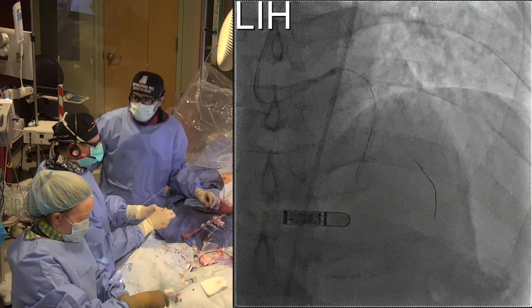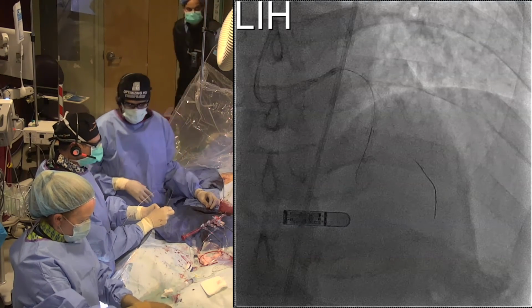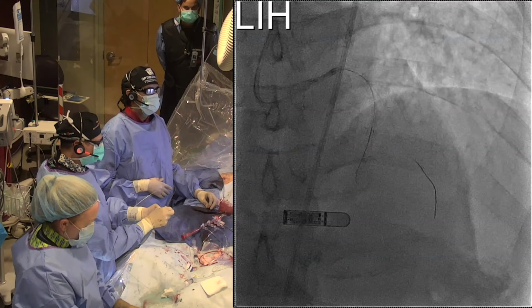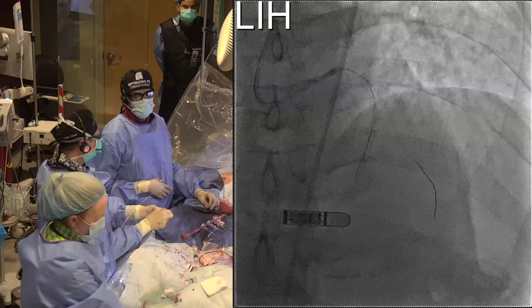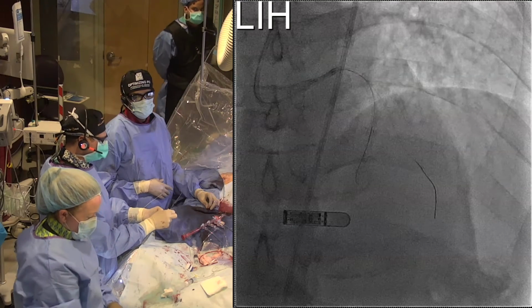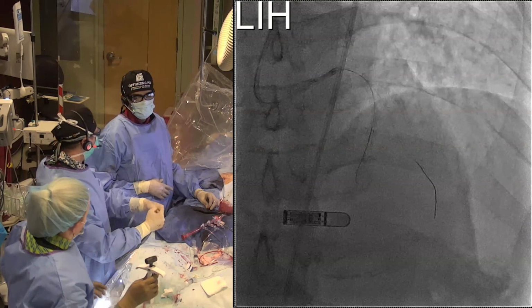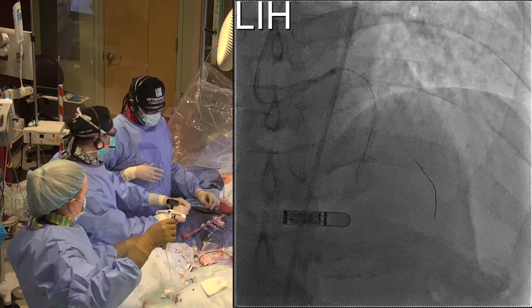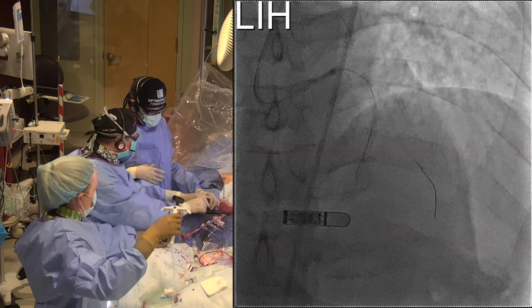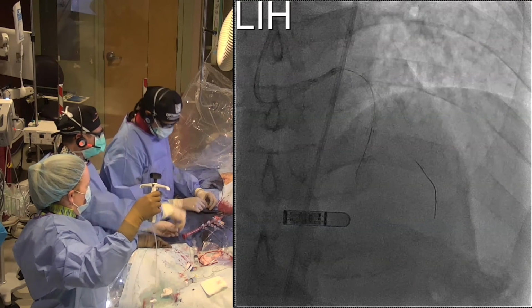Let's say you have a wire that can do everything. But let me just say one thing. The only concern I have with that strategy would be that you're just not going to maximize your stent expansion. And even though the acute result is good and you don't have a pressure gradient, if you could make it a square millimeter or 1.5 millimeters larger, your TLR is going to drop significantly.